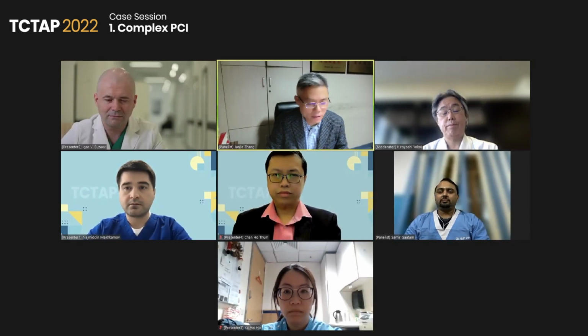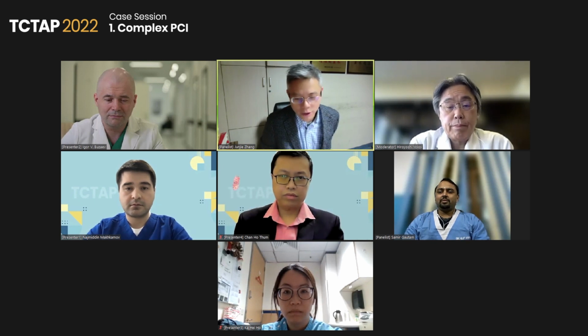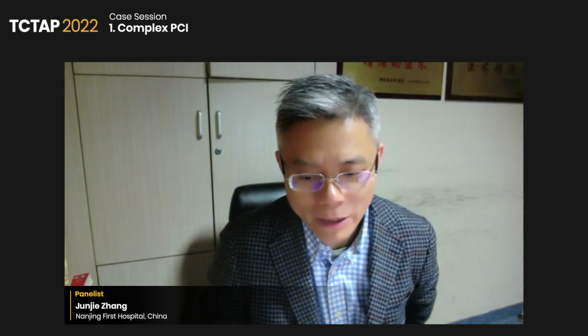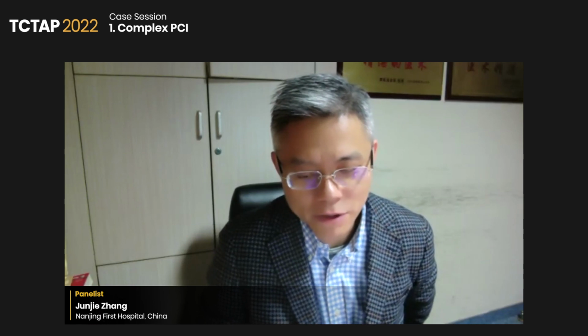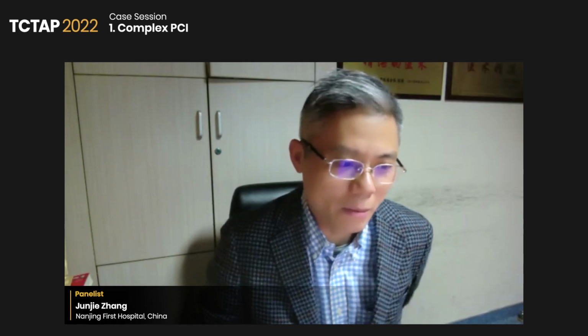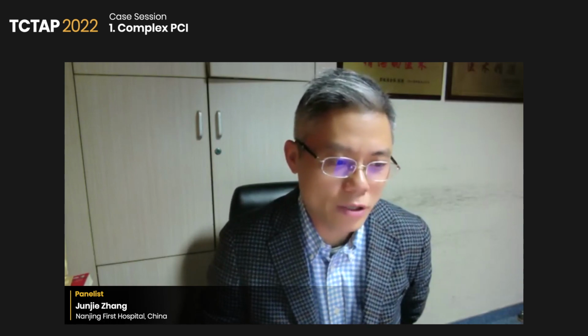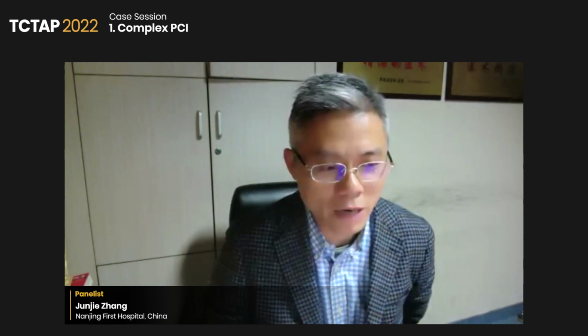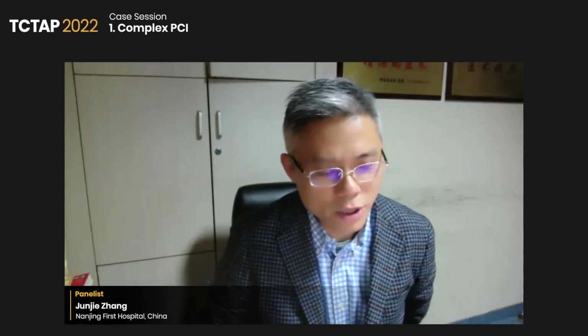Yeah, I think it's a challenging case. It's a proximal RCA total occlusion, and also the lesion length is quite long. So from the bilateral injection, I think the first choice of our operator is to use the ADR. I fully agree. Finally, after failing to puncture the distal cap with the retrograde guidance and also with the antegrade IVUS guidance, re-entry is into the true lumen.